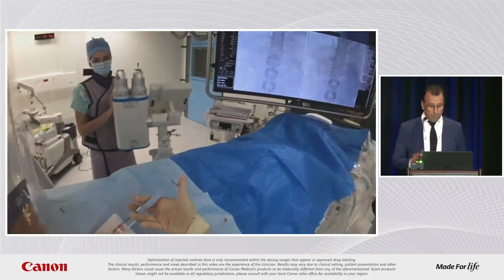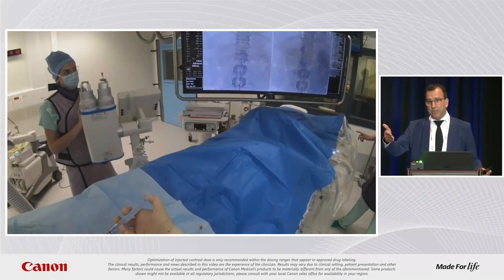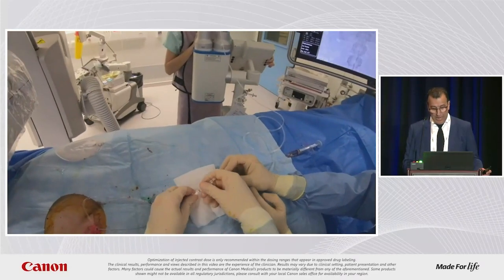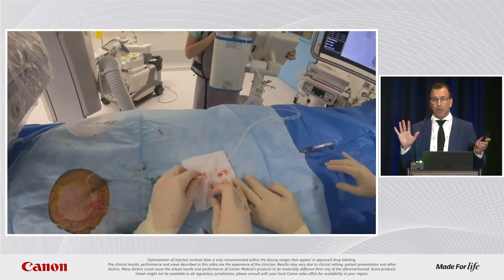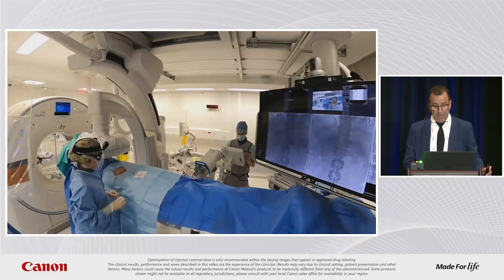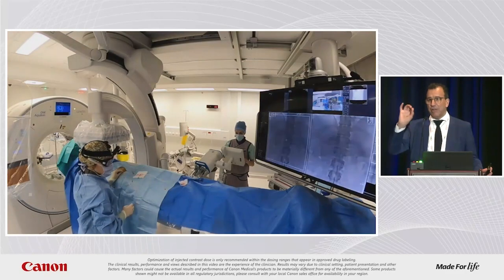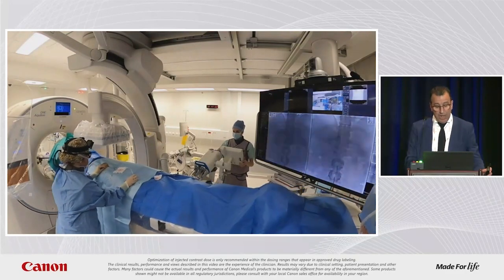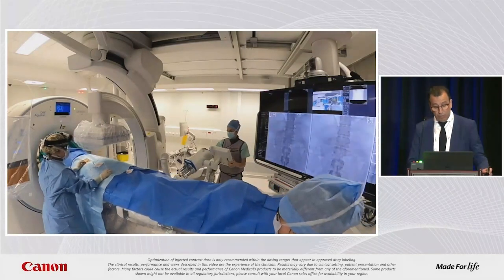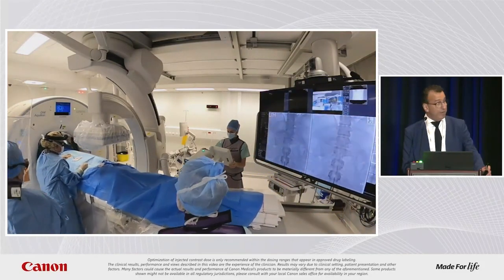Here we are. So at this moment, you have the possibility to choose the volume you want. From 2 centimeters to 16 centimeters acquisition, the machine can make a fusion between angio and CT. You can use it as a mask and bring it to the other side. You will tell what you want to embolize. It will show you exactly which vessel you have forgotten, which one is feeding the tumor, without forgetting to embolize. And you see, for a case like this, that's a patient we are following up. The Mets is visible in MR here in front.